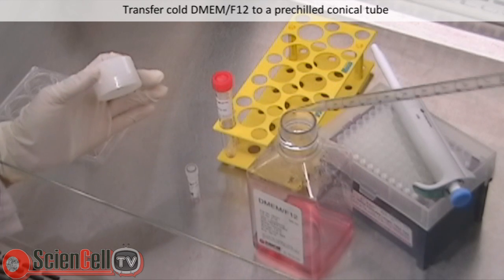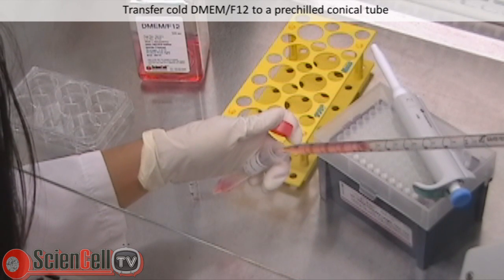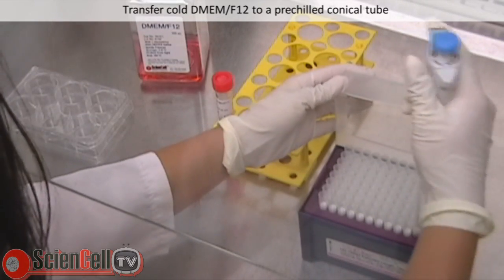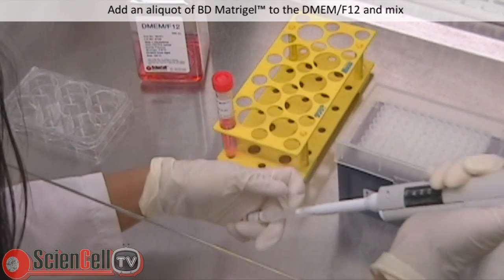To begin, follow the manufacturer's instructions by thawing BD Matrigel overnight at 4 degrees Celsius. Next, transfer cold DMEM/F12 to a pre-chilled conical tube. An aliquot of thawed BD Matrigel is then added to the DMEM/F12.